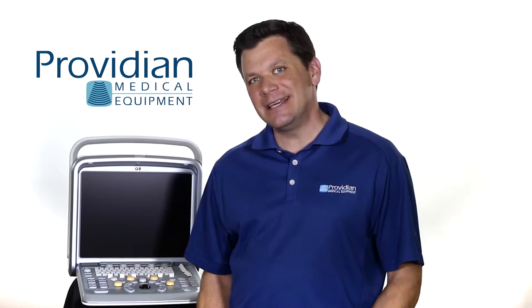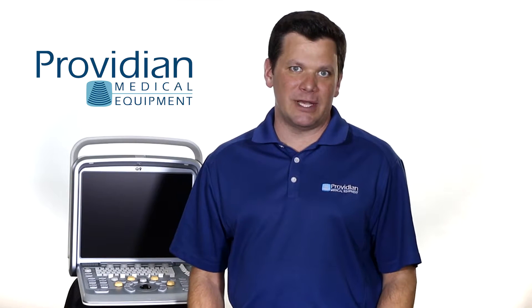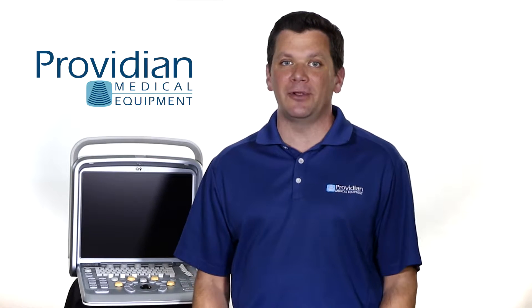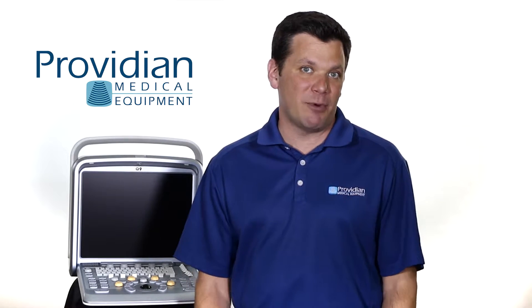Hi, I'm Brian Gill with Providian Medical, and this is the Chison Q9 portable ultrasound machine. The Q9 is a mid-range portable ultrasound machine that has entered as another strong competitor in this very popular and competitive mid-range market.